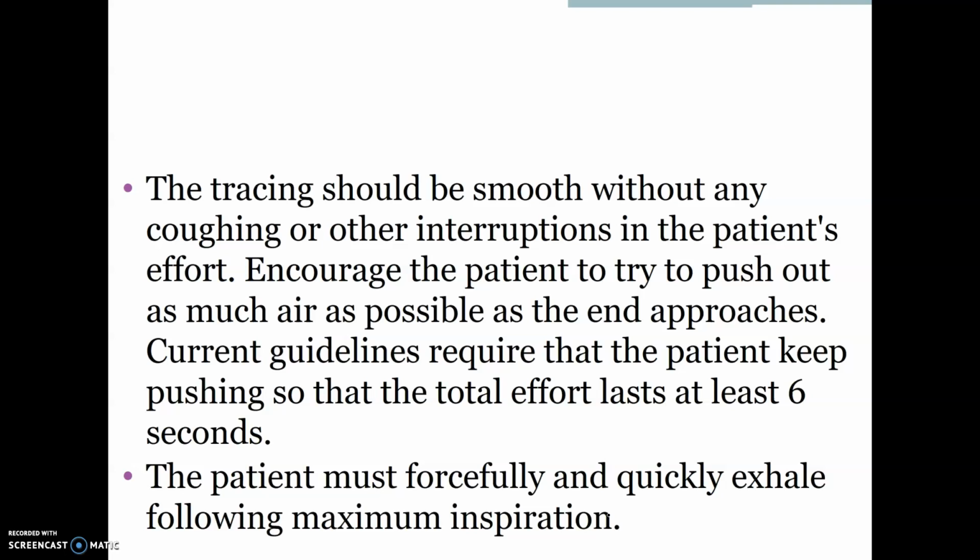If you do this at home, you can take a deep breath in and then blow all your air out as hard and forcefully as you can and have it last at least 6 seconds. It's a lot harder to do than what people think, but we have to get all of that air out of their lungs that they are able to exhale when we're doing the forced vital capacity. They forcefully and quickly exhale all that air out, and then they do a maximum inspiration at the end of that forced vital capacity or flow volume loop.